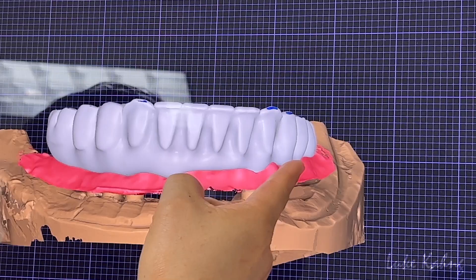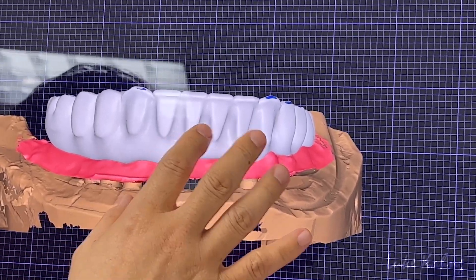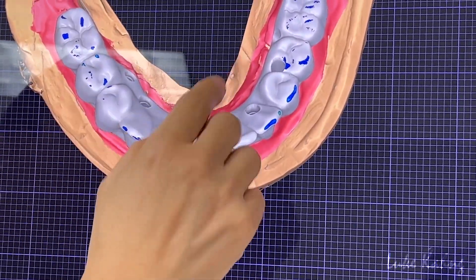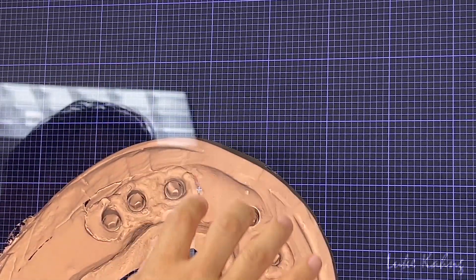Trying to slightly cover underneath — just the hygiene pontic area as well. They put occlusion contact. This is the implant site.